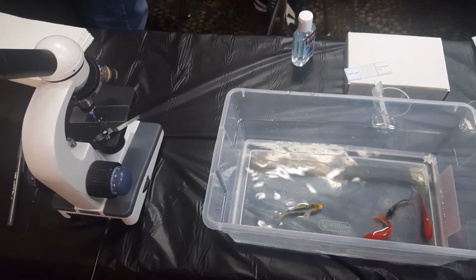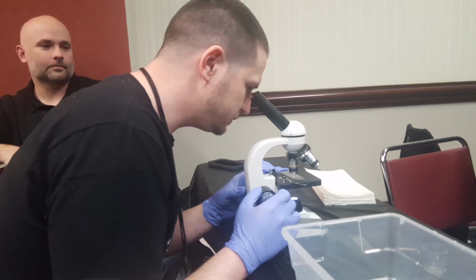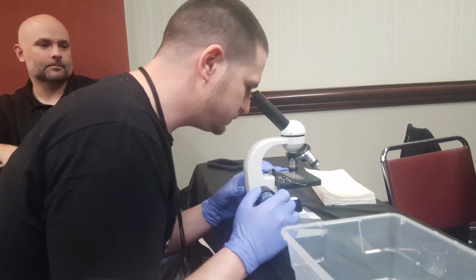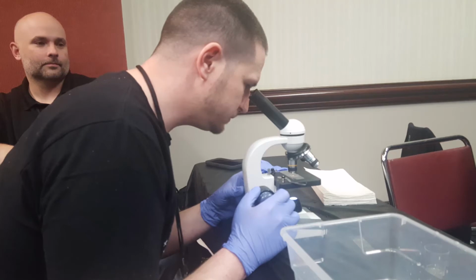It was horrible. Next, I was looking through the microscope at one of the scrapes that Chris Klein did on the goldfish, and we found flukes, we found ick, and we actually found costia. It was really hard to see. You have to look really closely on a high magnification, but costia is there, and you can see it in this video that Chris took. So props to Chris. Thanks for taking that.